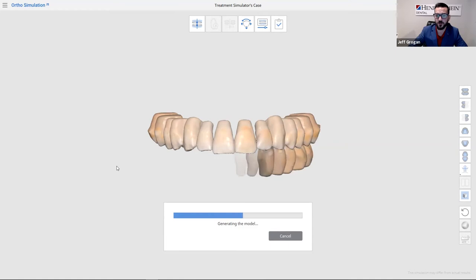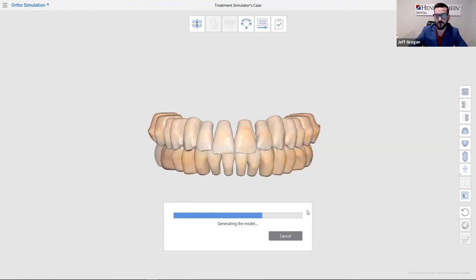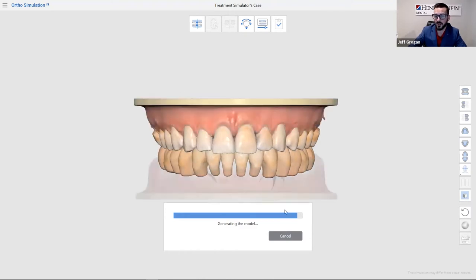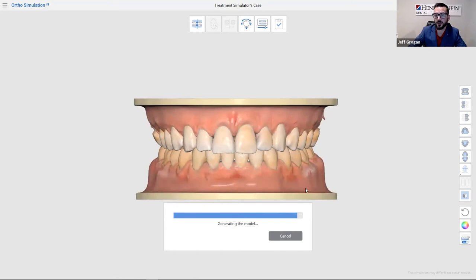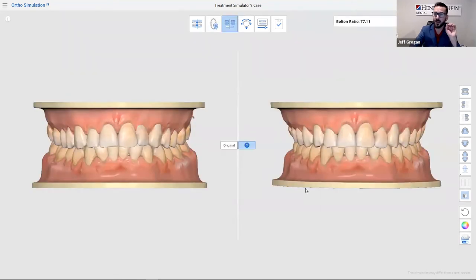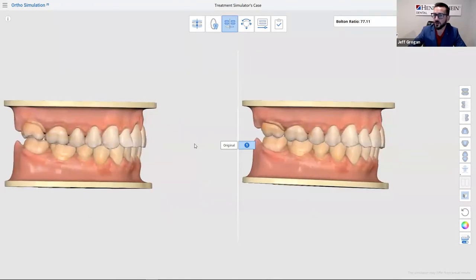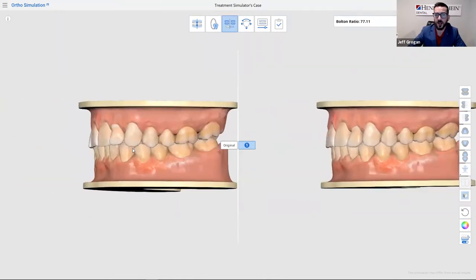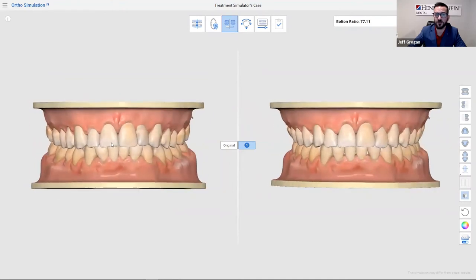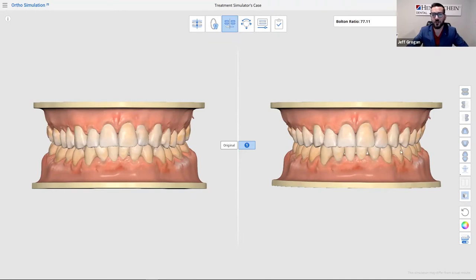You'll see the tissue start to come in and the base start to come in. Here are my models — my initial scan compared to my actual ortho simulation. With rather few clicks, I now have a presentable case for the patient: original on the left, new on the right.